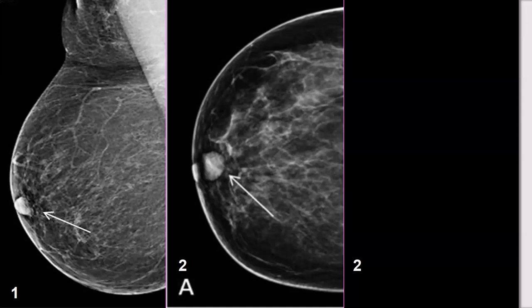But did you hear me say that the nipple is smooth laterally and the surrounding lucency is lateral but indistinct medially? Because the outer portion is surrounded by air, it will be lucent. What about this here? We could not see the nipple. Here, is it smooth and sharply defined laterally and surrounded by air? Not surrounded by air laterally. Okay, so the medial, inner portion is more defined than the outer portion.